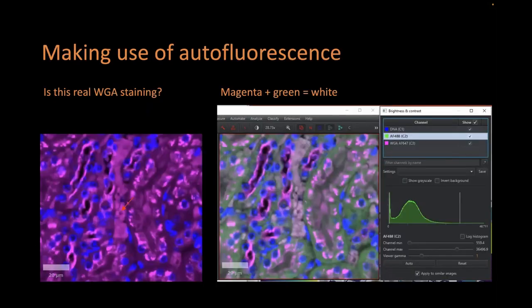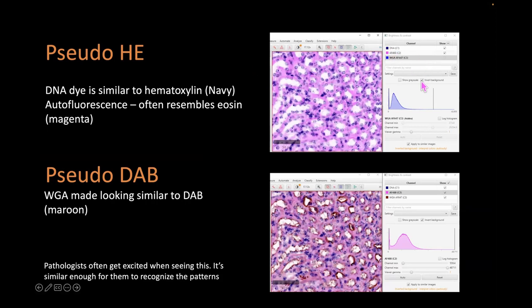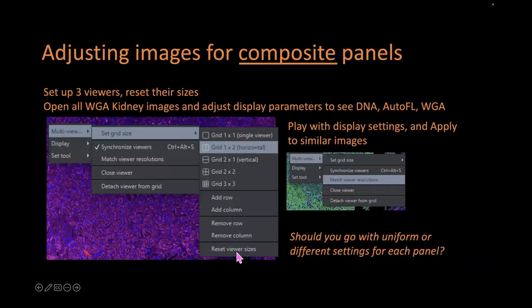For people who have pathologists on board but are working with fluorescence data, there is a way to convert fluorescence images into something that looks like pseudo-H&E and pseudo-DAB. This can bridge the gap between the pathology world and fluorescence work. You do this by inverting the background, then assigning colors — for example, make hematoxylin navy and the fluorescence channel that resembles eosin magenta — and that image will look like a classical H&E stain.